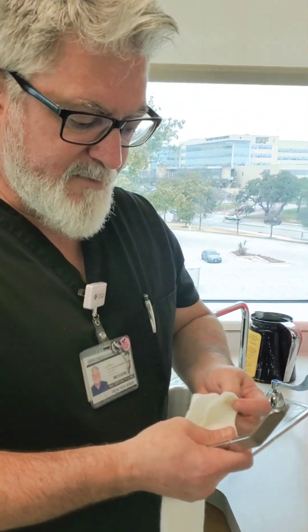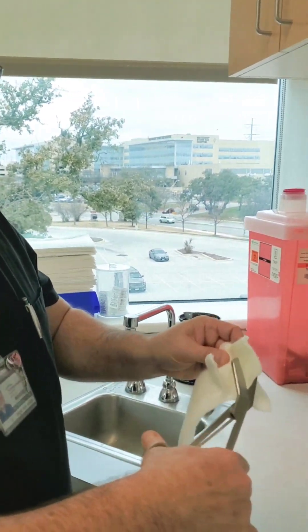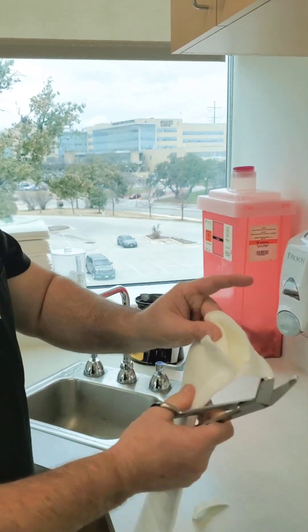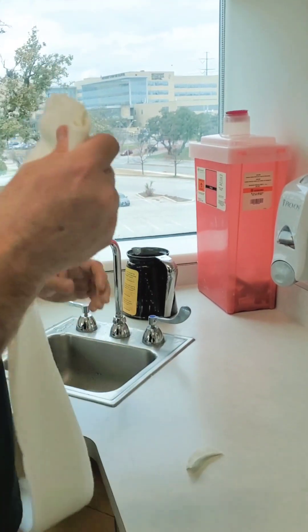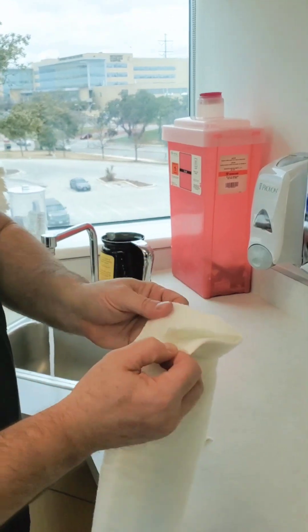We've measured out a strip of ortho glass — in this case a three-inch wide strip. I'm going to get rid of the excess on the edges, cut off the corners, and remove any little shards that stick up. I'll do that on both sides, then warm up my water so I can heat it up.